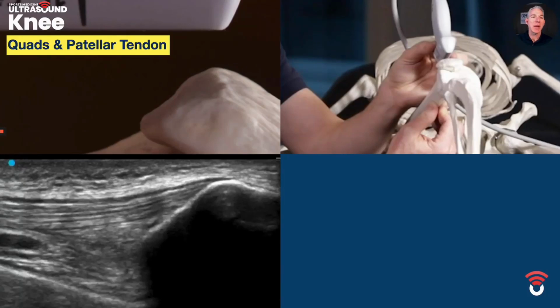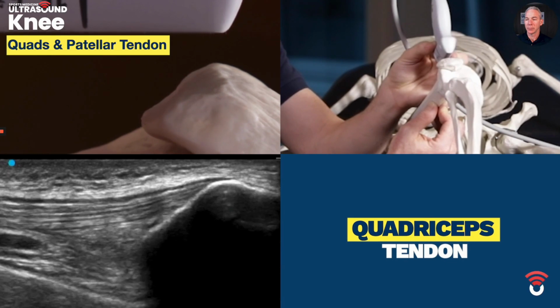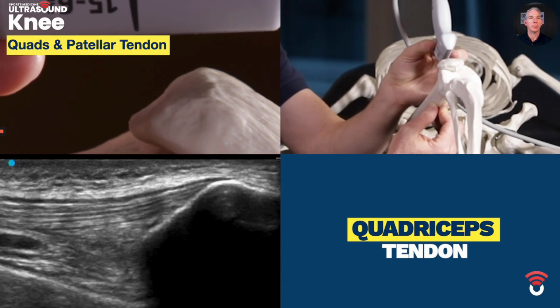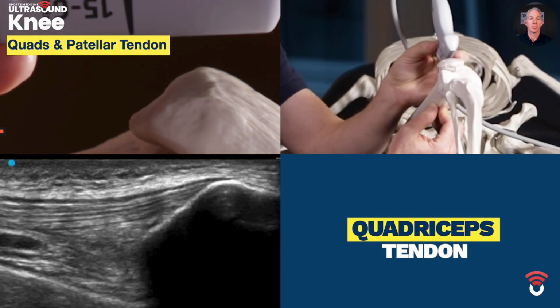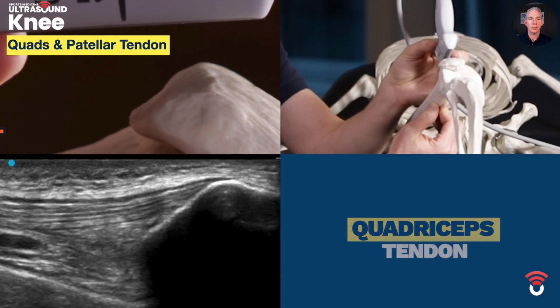Okay, time for quadriceps and patellar tendons. Now, everything is still the same if we want to scan the distal quadriceps tendon or the quadriceps tendon insertion at the proximal pole of the patella. However, in this case, we generally slide or move a little more distal and sweep through both lateral and medial until we see the entire thickness or width of the quadriceps tendon. So that's how we scan for the quadriceps tendon.